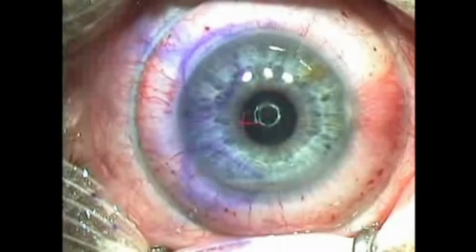Low vacuum is engaged on the system. Additional drops are placed on the separator and epithelium, and the reverse foot pedal is used to back off the keratome. Once the last of the epithelium has left the separator, suction is removed. The microkeratome is lifted from the eye, lifting nasally first to cause minimal displacement of the epithelial flap.